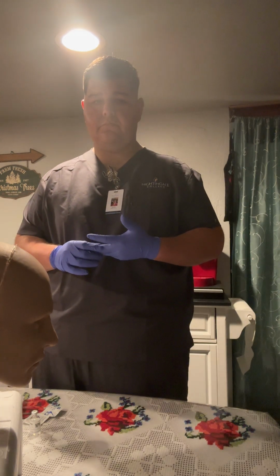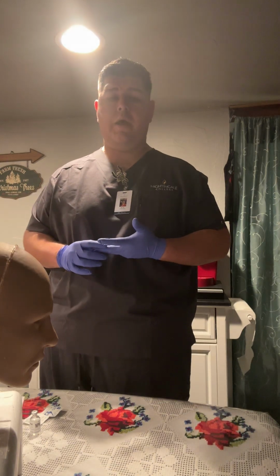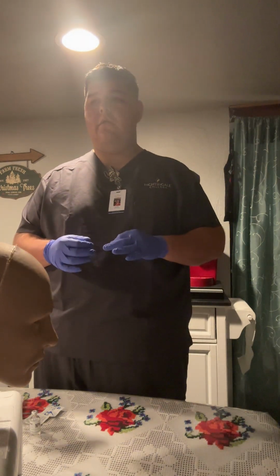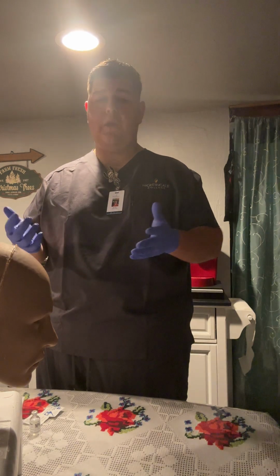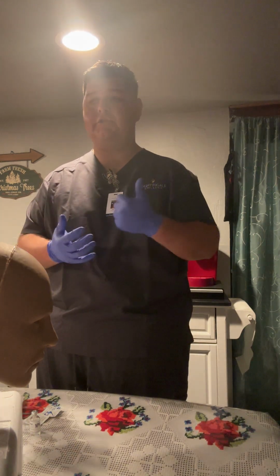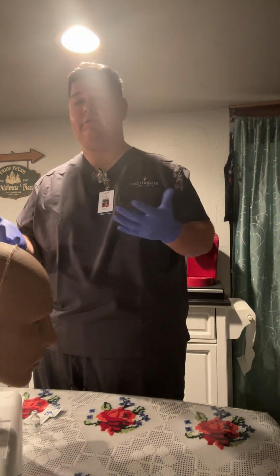Nope? Perfect. Okay, so at this point, I want to go ahead and verify my medication with the MAR for the third time. And this will be my third and final time. Additionally, I want to get the patient's glucose levels. I want to check their blood sugar so I can determine when the next meal is and then how much insulin to give, of course.